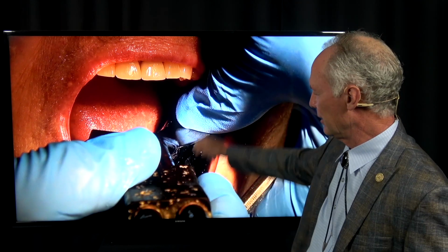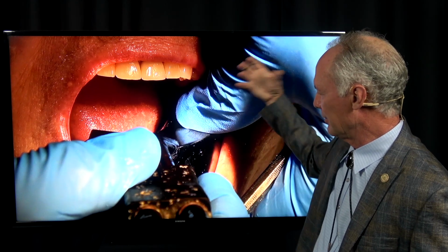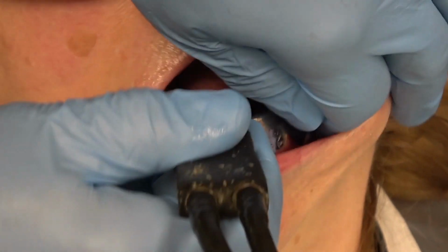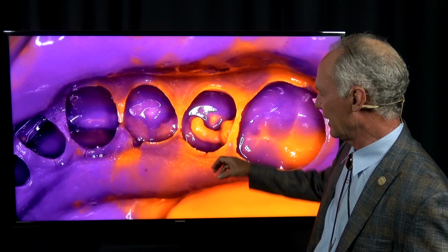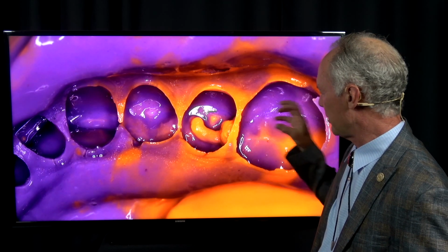If you put it in warm water or hot water, it makes it liquefy. So when you want to set, you run cool water. See how just deadly accurate. It doesn't stretch, it just pops out.